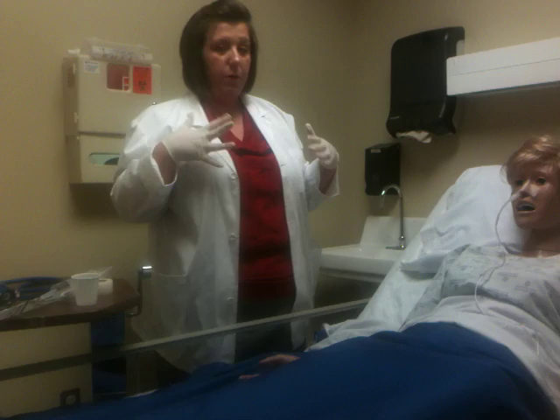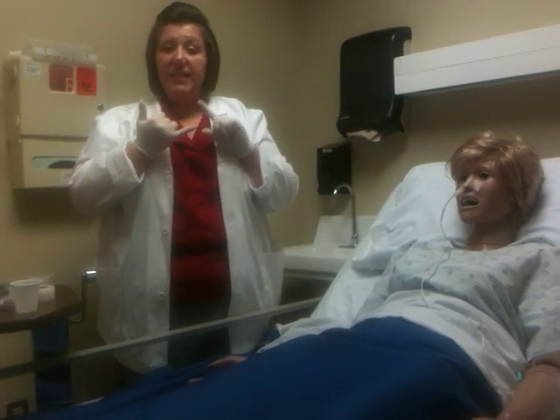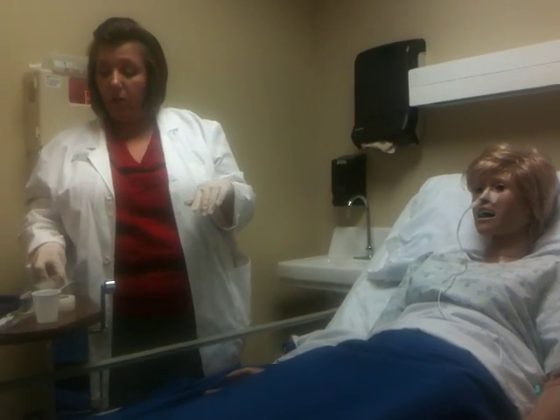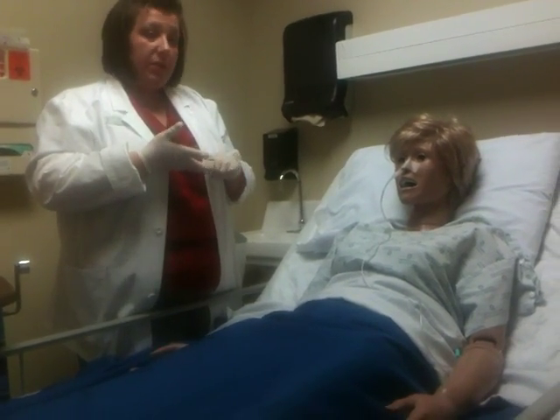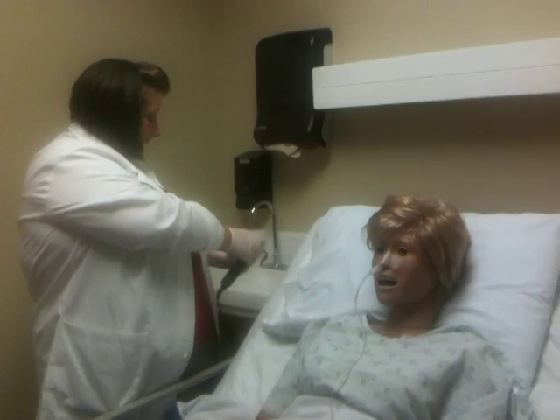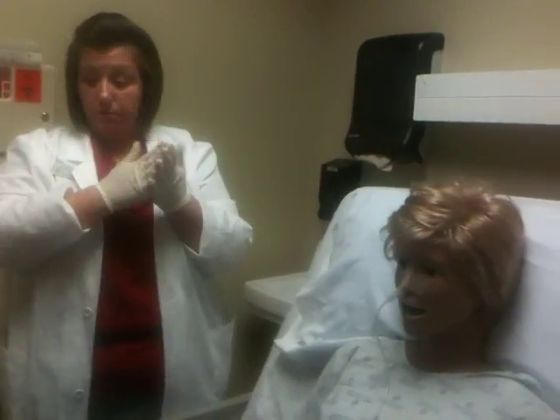So now let me talk you through the removal. Again, you would have to check your physician's order and make sure that you had a doctor's order to take it out. You would need a towel, your gloves, and a 60cc syringe again. You would go through the same procedure of coming in the client's room, performing your hand hygiene, verifying you had the right client, explaining the procedure. Go ahead and put her in a high Fowler's position. Okay. You would make sure that you put your gloves on.